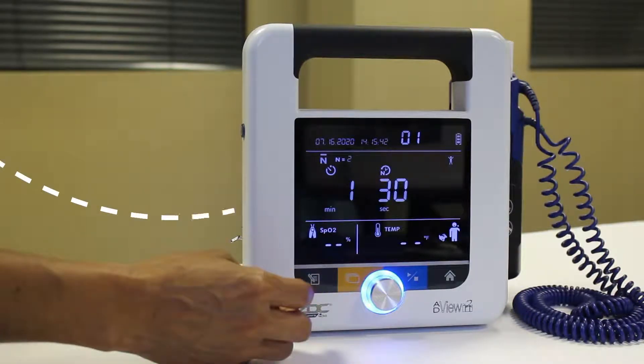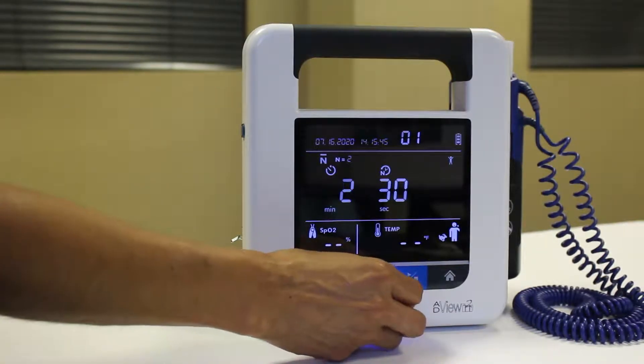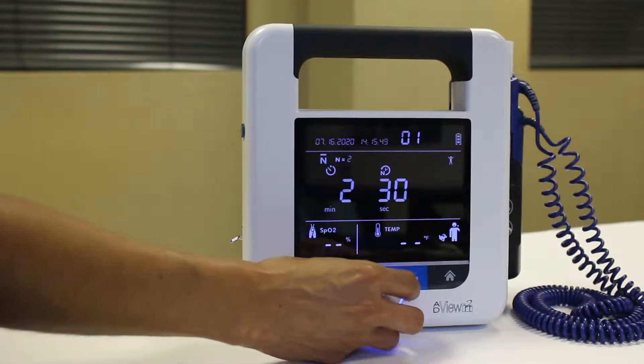Next, the time before first measurement icon will flash. You can choose a first reading delay from 1 to 5 minutes in 1 minute intervals. To keep the current setting, press the knob. To change the setting, turn the knob to choose the desired delay and then press.